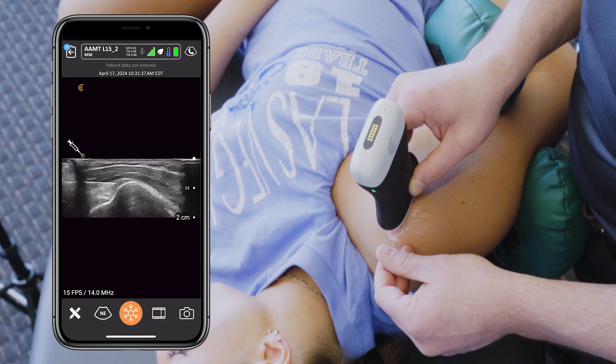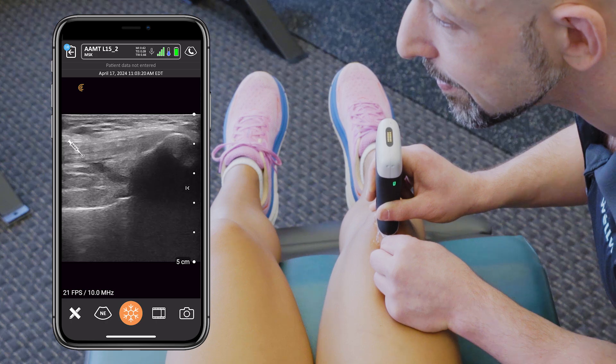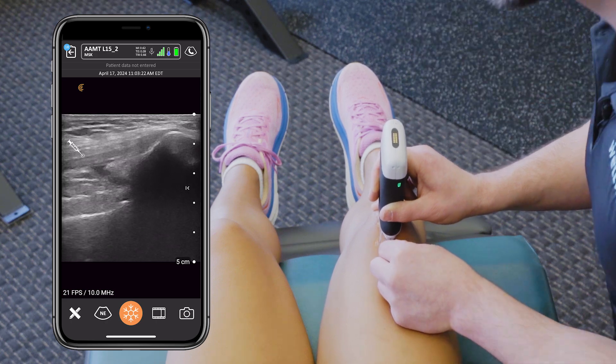I thought I knew anatomy, but it wasn't until I started to incorporate sonography into my regular practice that I realized I didn't know what I didn't know. And now I can see in the moment the depth of the anatomy that I was missing.